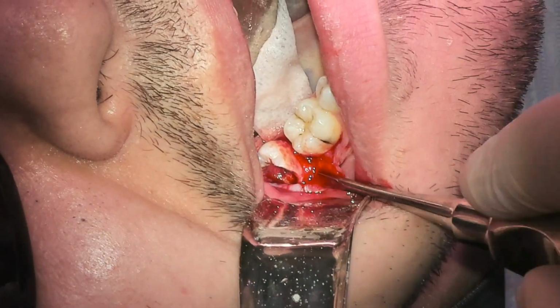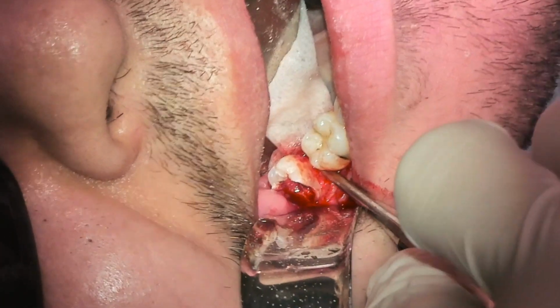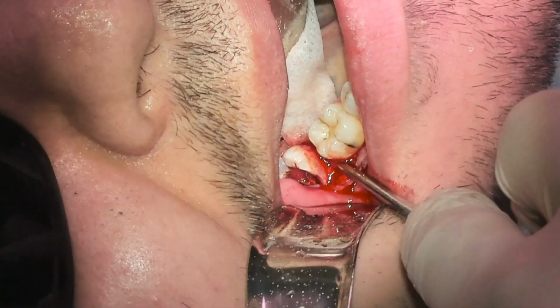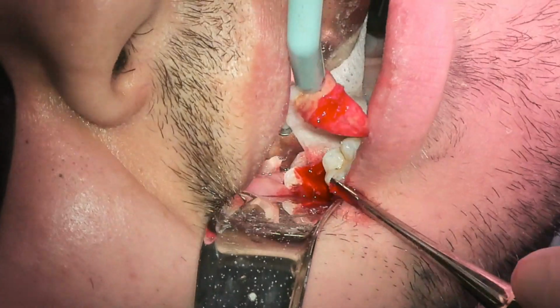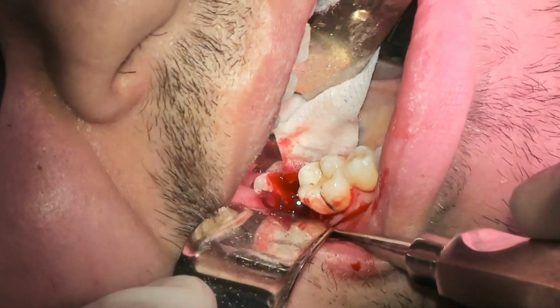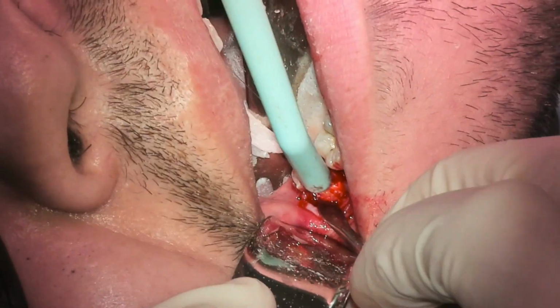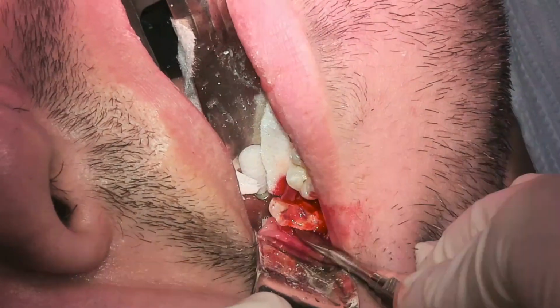And I see a lot of mobility right now, which is very good. So we'll go ahead and take our time. Don't rush anything. And then it should come out very soon. There you go. Okay. Now the mesial aspect of the tooth is gone. Now let's go ahead and work our distal aspect. Now I can see the bone as well here, because we removed that excess gingival overgrowth. And then we go ahead and elevate it towards the mesial, and it should separate very soon as well.